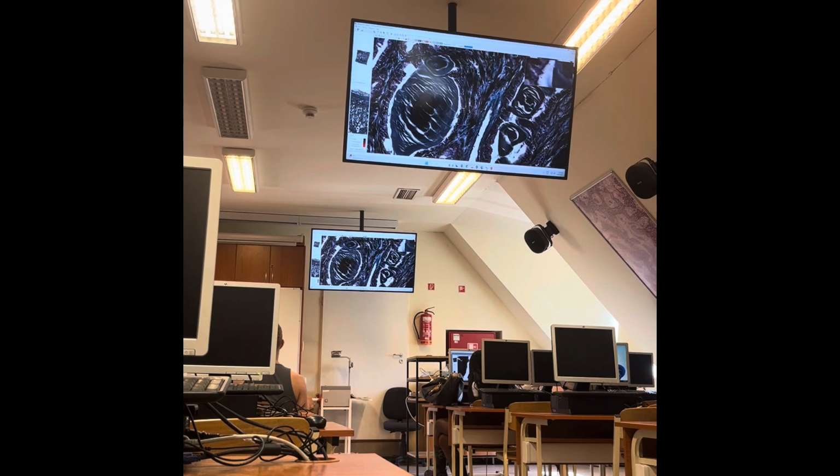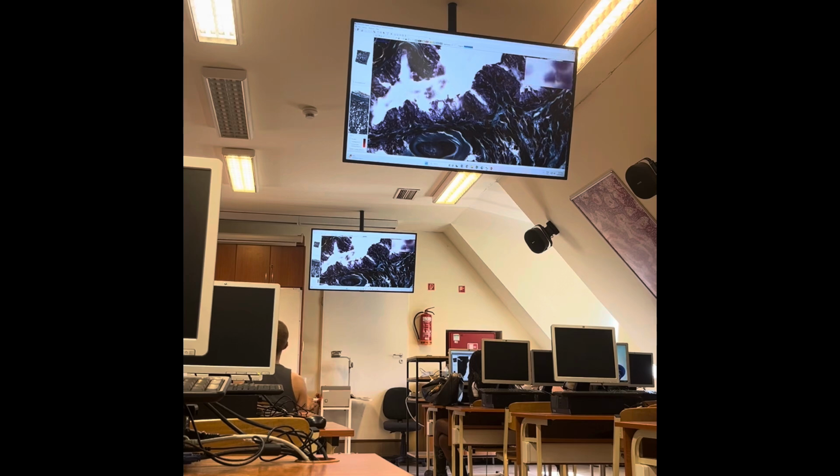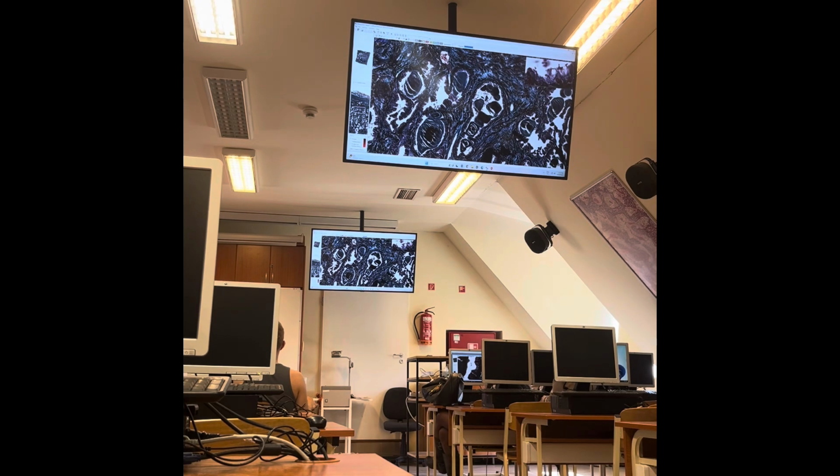It's maybe natural because many of these structures don't fill the entire lumen. So they start as small precipitations. Maybe shed epithelial cells can be the starting point of the precipitation of the secretions, and then gradually more and more layers are added to these structures. So they not necessarily fill the entire lumen.